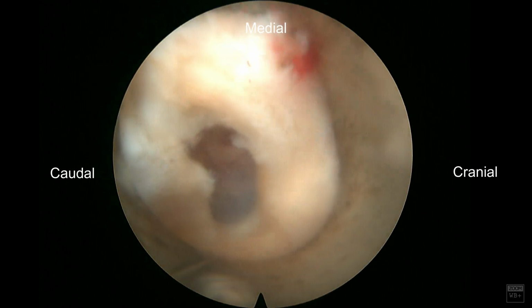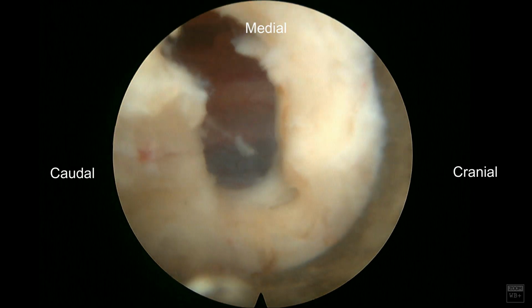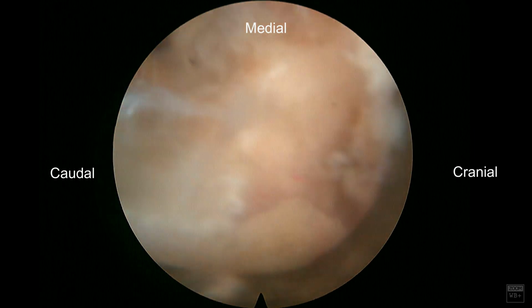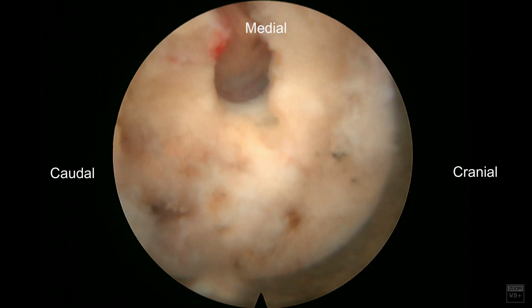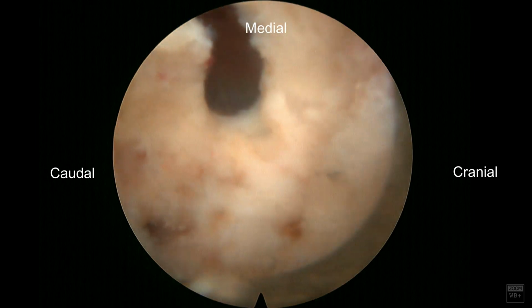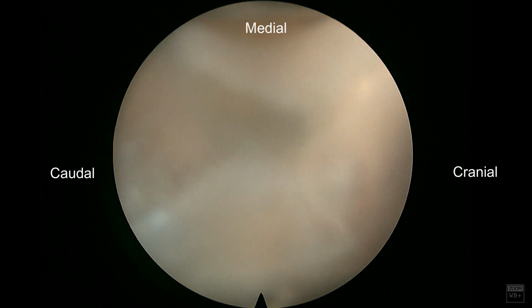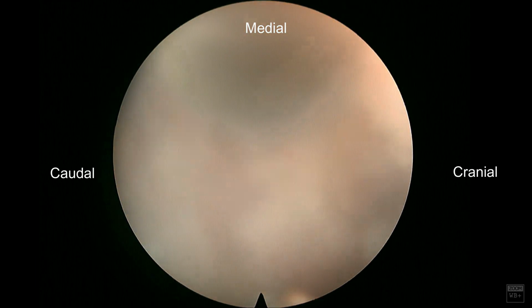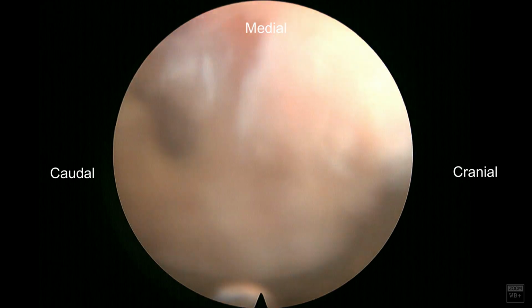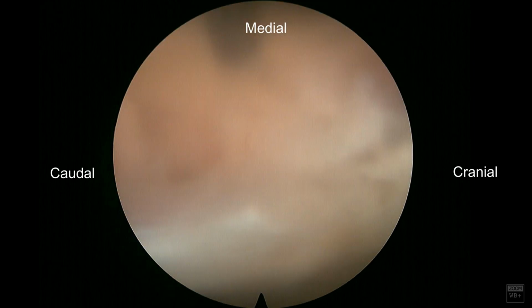And so now that we've got our entrance to the spinal canal, you can see the dura there. I'll leave that there, and I won't continue to enlarge it because I want to protect the dura from the diamond burr when I perform my hemilaminotomy. But at least I can assess my location of the traversing nerve root, and this will give me an idea of how far I need to decompress laterally.